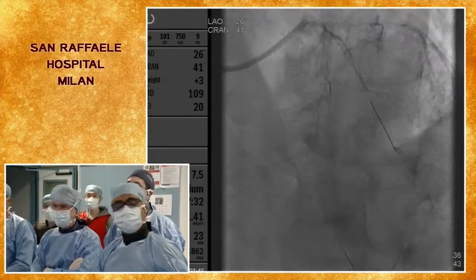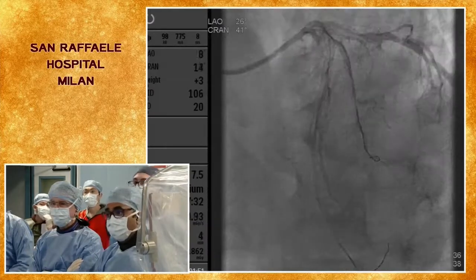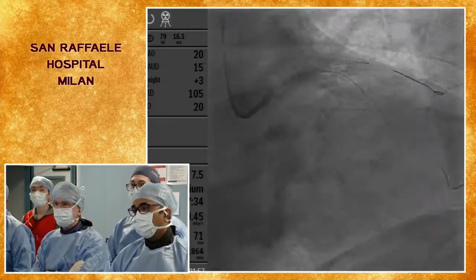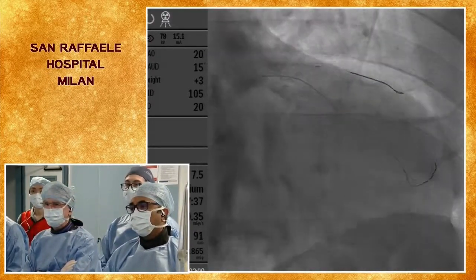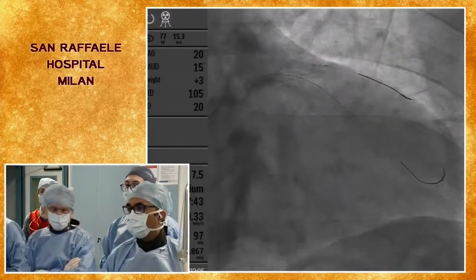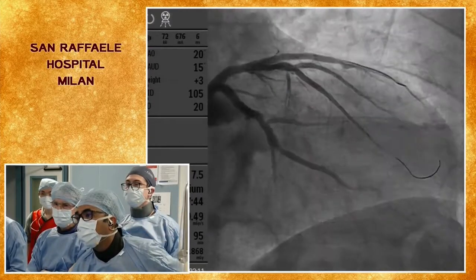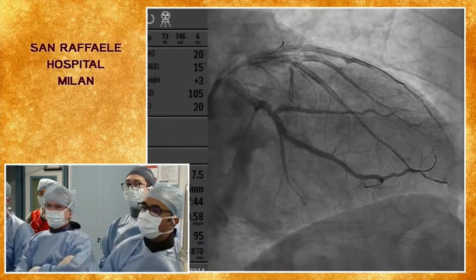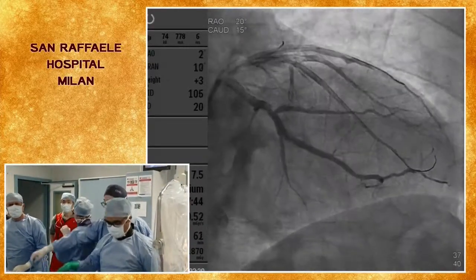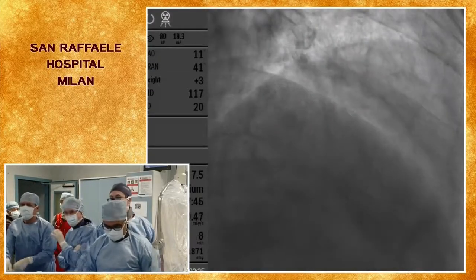Let's go in the RAO. Vediamo obliqua destra, 20-20. There is no question that with the stent that dissection will disappear. But I think with the IVUS result, let's do, Azim, another IVUS now. Make sure that the dissection is stable. Okay, here is very good. It's not bad. Another IVUS: check that the dissection is stable, that the lumen did not deteriorate, that it's still 4.3. If it's the same, we're not going to do anything.